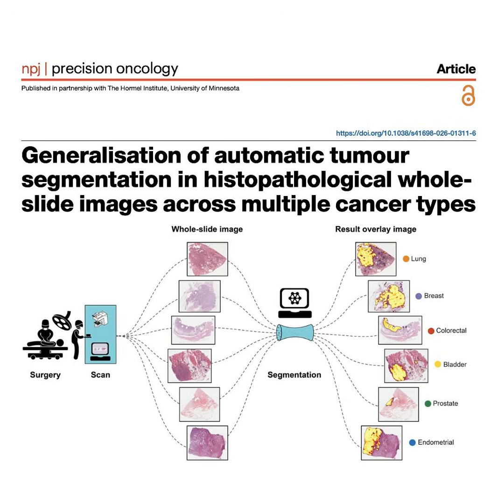Oh, wow. So what does this all mean? The AI actually agreed with the original human doctor more than a second expert human doctor did. You did. But I have to push back on this a little bit. Go for it. Does this mean the AI actually discovered some objective universal biological truth about where the cancer begins and ends? Or did it just learn to brilliantly mimic the specific psychological style of the doctor who trained it? Because all of that original training data was labeled by pathologist MP.